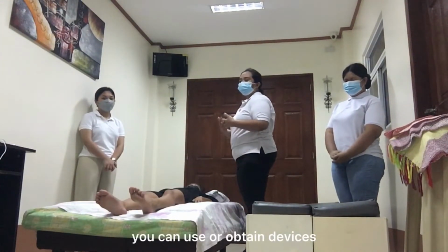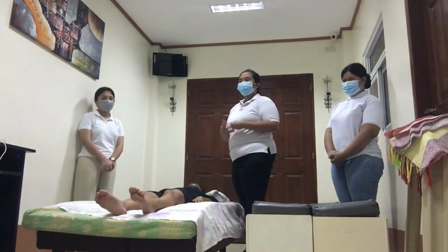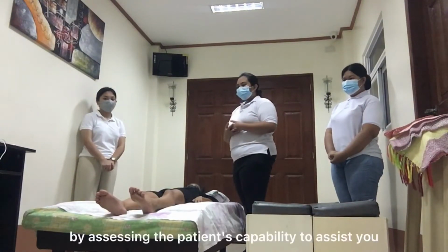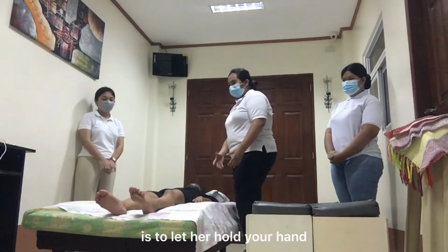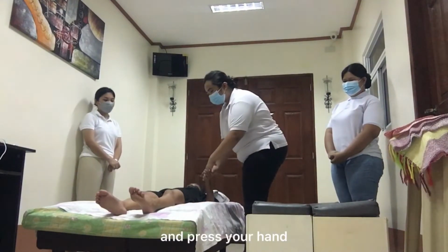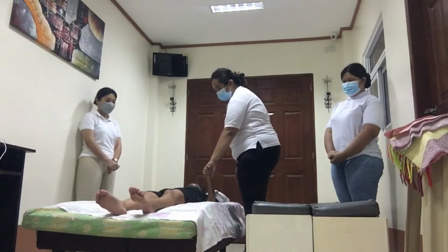You can use or obtain devices, lifts, or caregivers if needed. By assessing the patient's capability to assist you is to let her hold your hand and press your hand. Okay, ma'am? Press my hand.